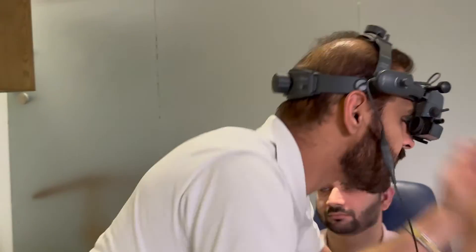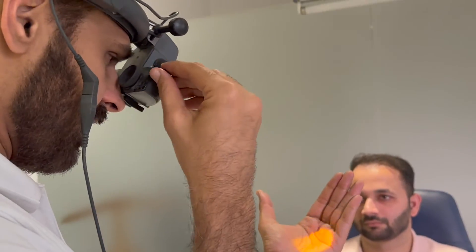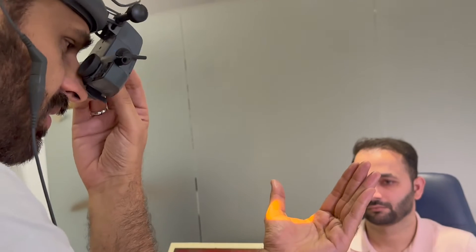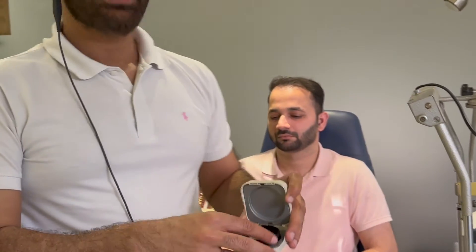If the patient is uncooperative, such as a child, you can use the indirect hat or indirect ophthalmoscope. Put the indirect on your head, switch on the light after adjusting your IPD, adjust the size of the aperture, and then hold the 20-diopter or 10-diopter lens. Dim the lights before beginning the examination.